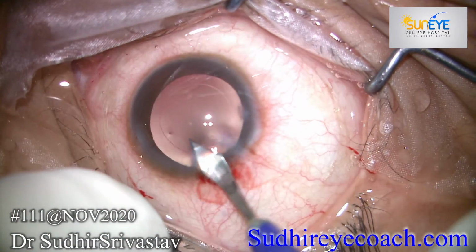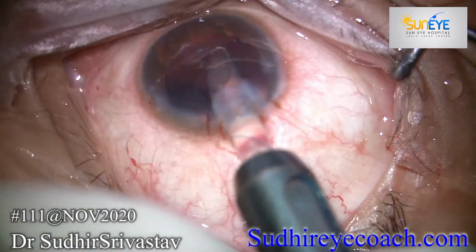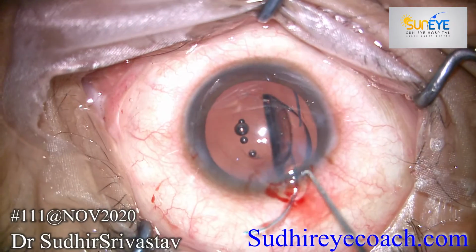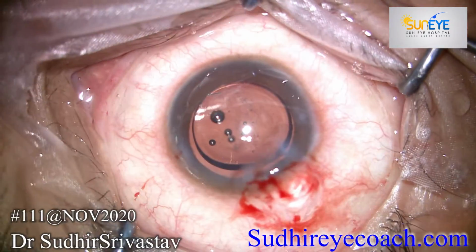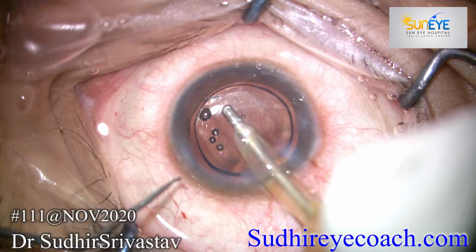It cannot be implanted through 2.2 mm, so extend the clear corneal incision to 3.2 mm. Insert the cartridge in, then start injecting the IOL. First the leading haptic goes in the bag, and then with the help of the dialer, dial the IOL, and the trailing haptic goes in the bag.